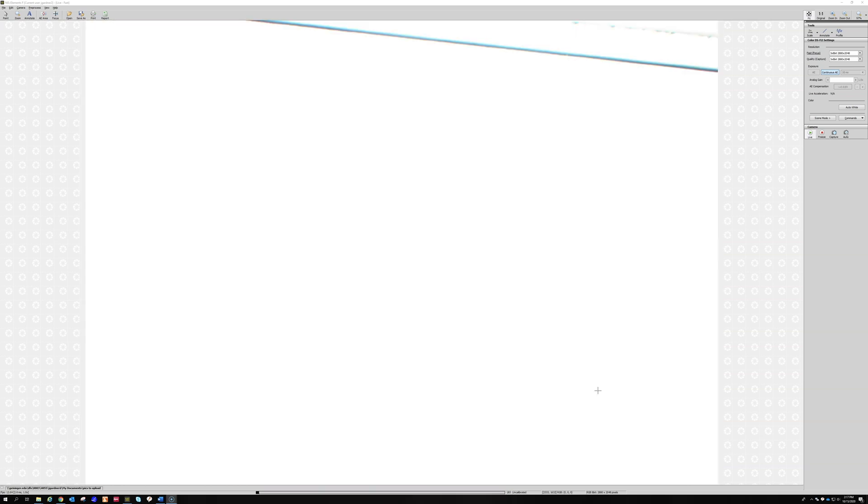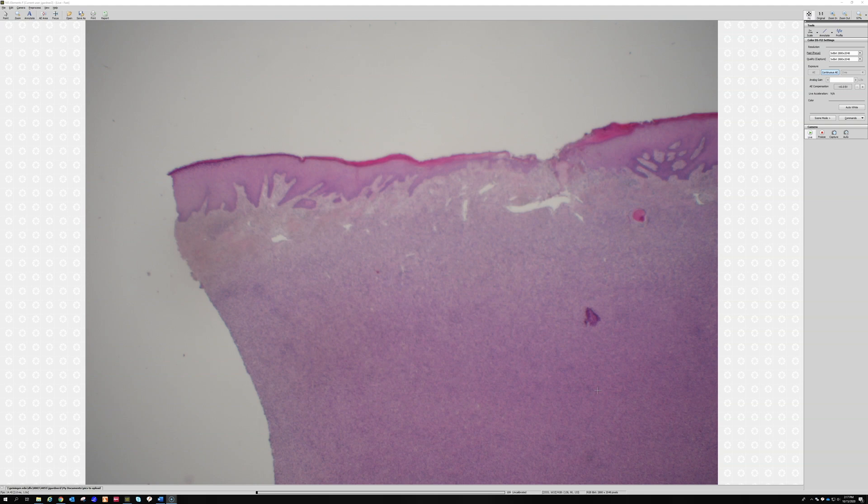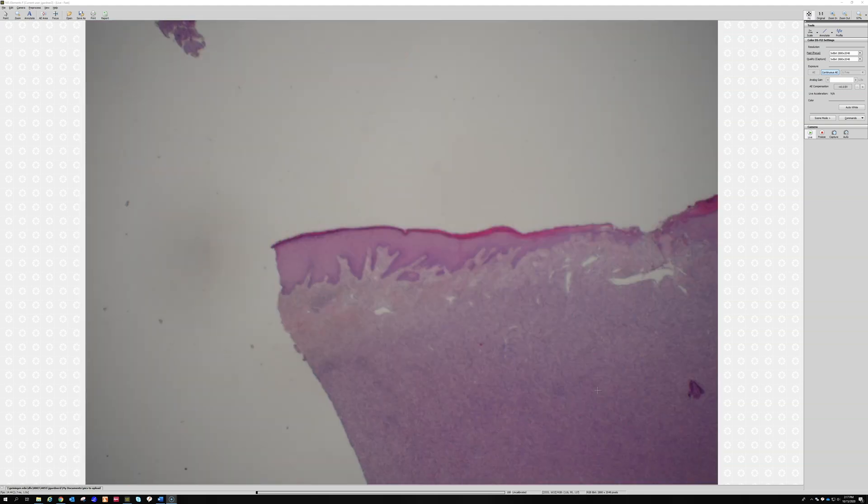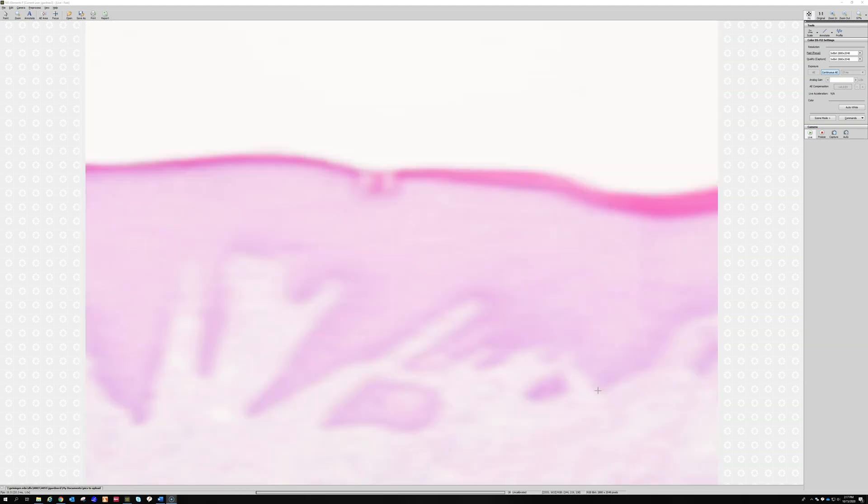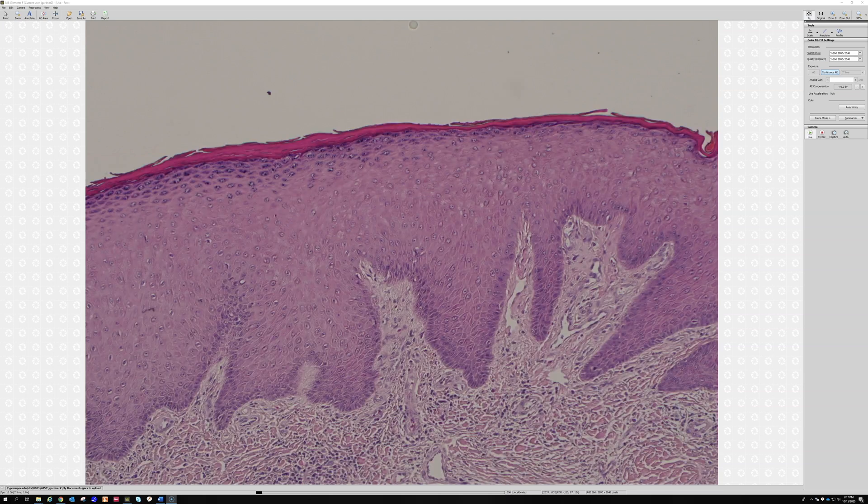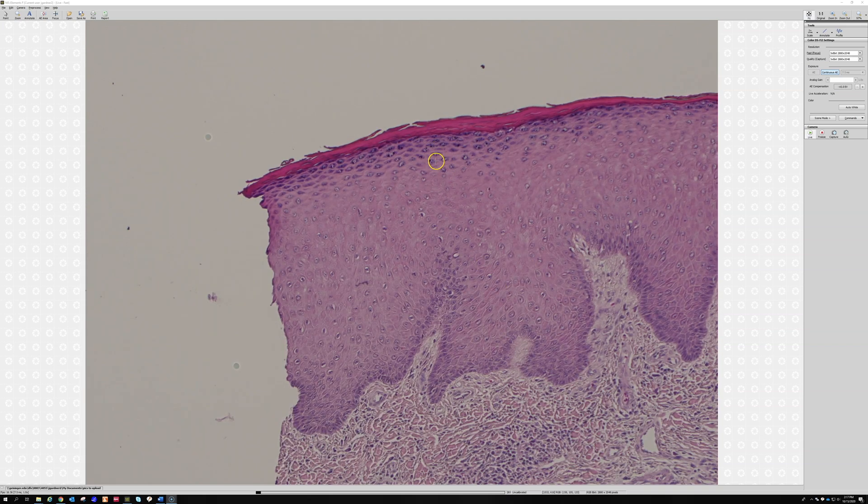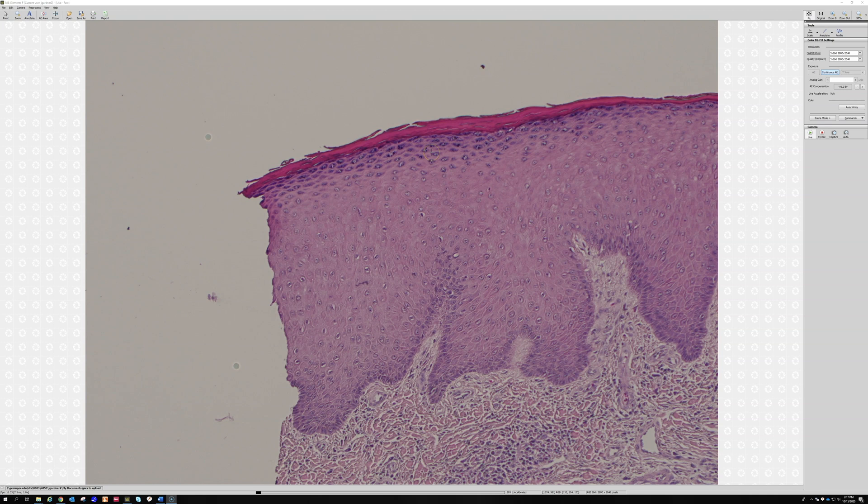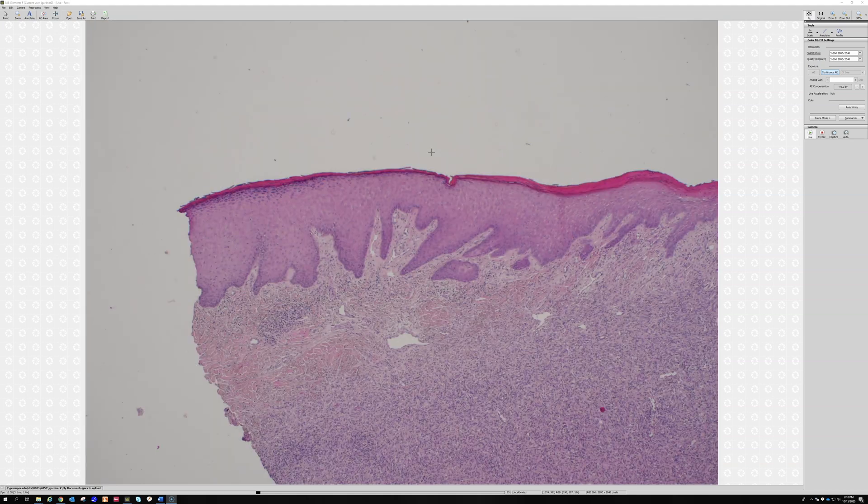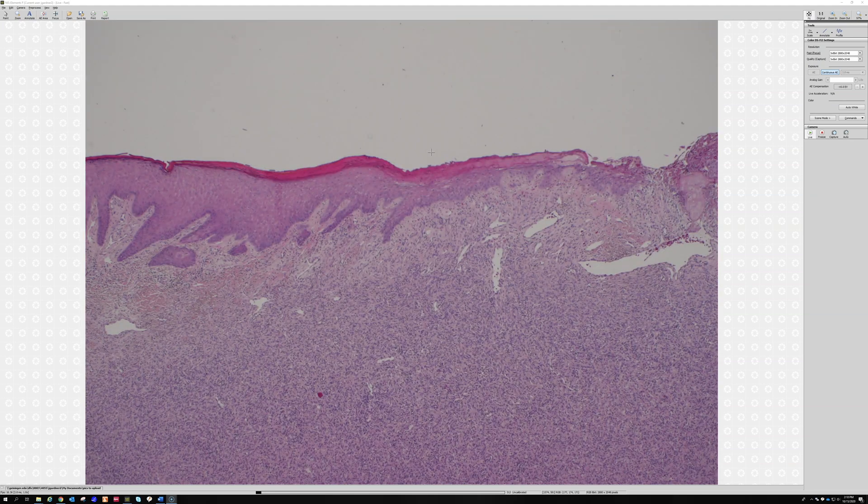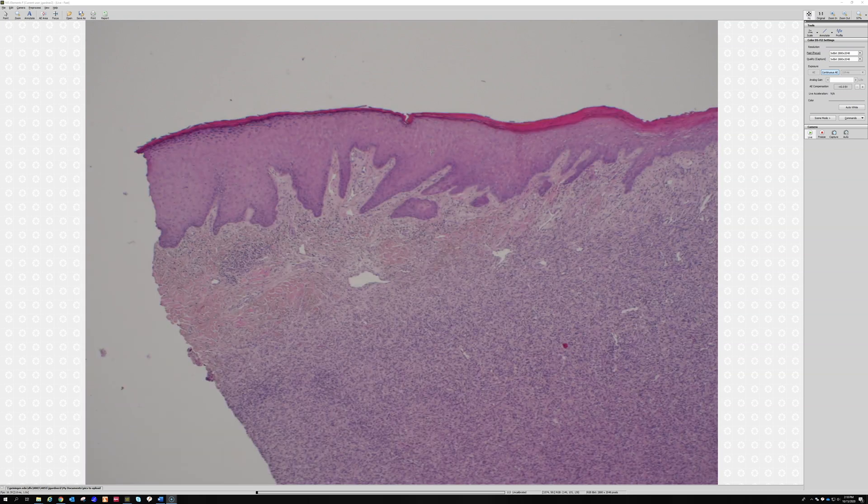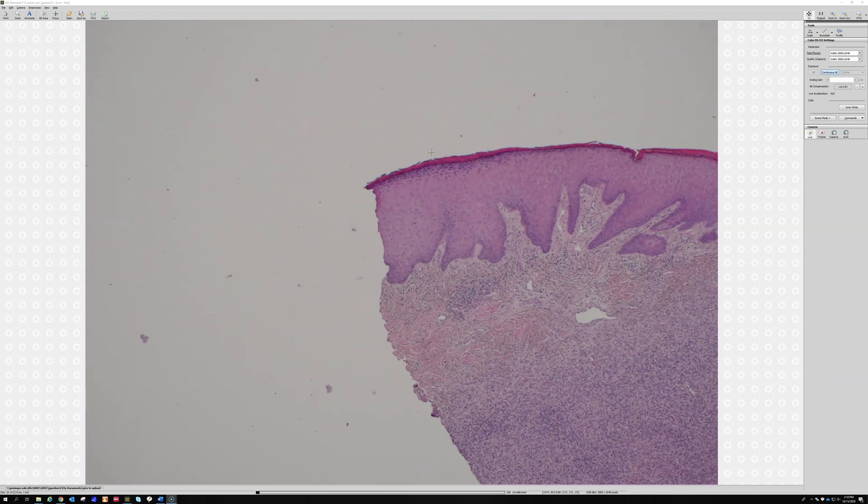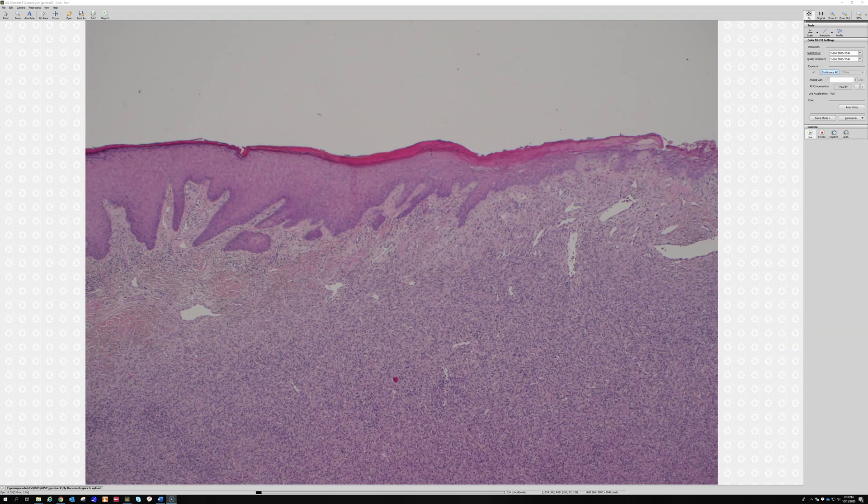Sometimes it can be helpful. This is where the dermpath clues can come in handy. This acanthotic thick epidermis has a real thick granular layer on top, and that's usually a sign of chronic scratching and rubbing, what we call lichen simplex chronicus change in dermpath. At the periphery, that tells me they've been rubbing and scratching at this not just recently but for a long time actually.